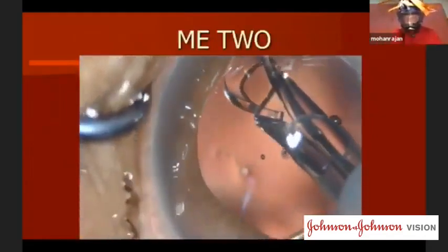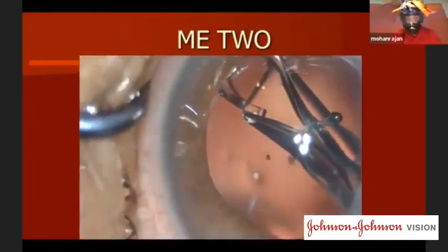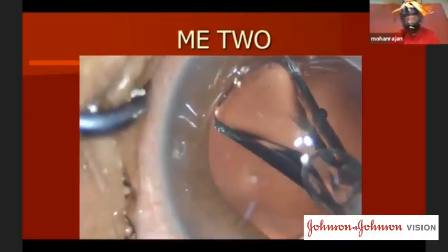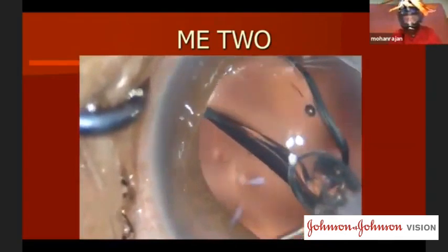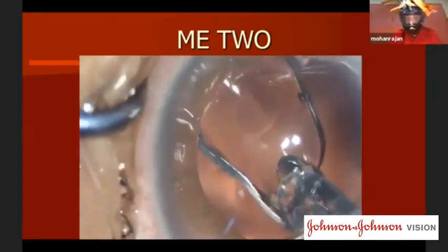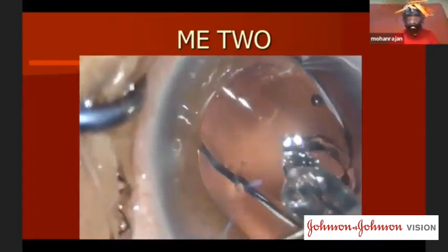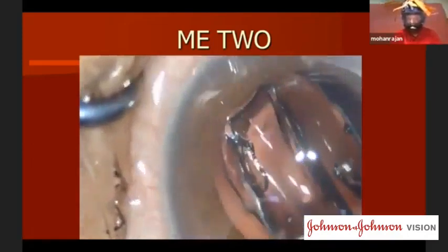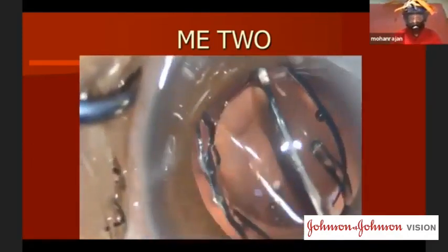This patient wanted bilateral simultaneous cataract surgery, and I put both the lenses in the same eye. What is this, both the lenses in the same eye? You can see the first lens, and then you can see the second lens also coming. This is again a preloaded lens. You can see here, first lens, and then the second lens also coming into the eye. This is the IOL nightmare. So what happened? I took the second lens and put it in the fellow eye as well.